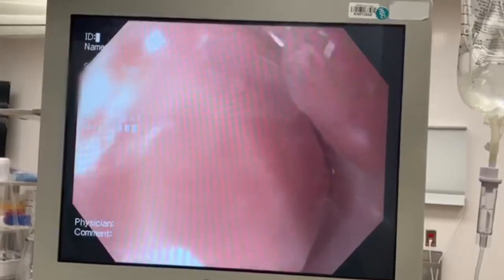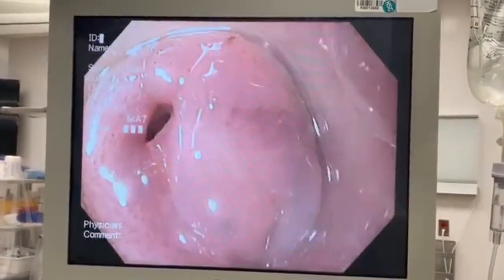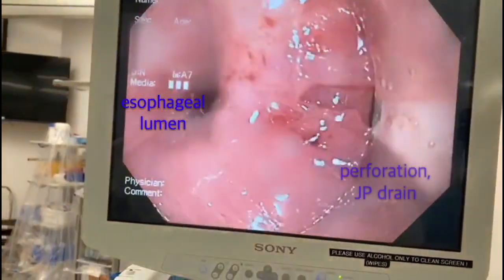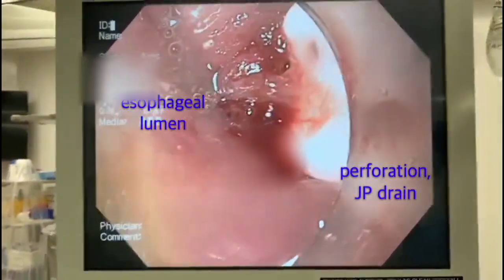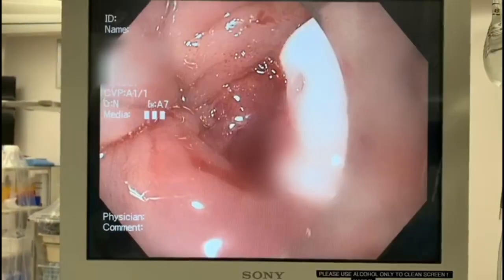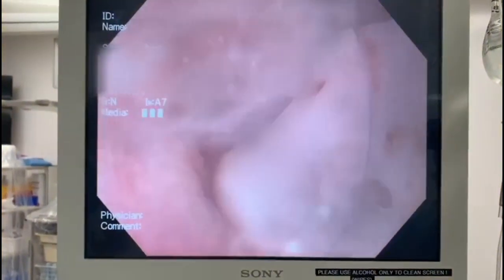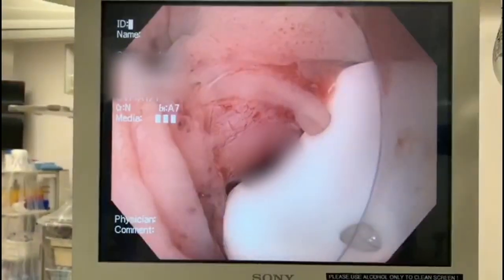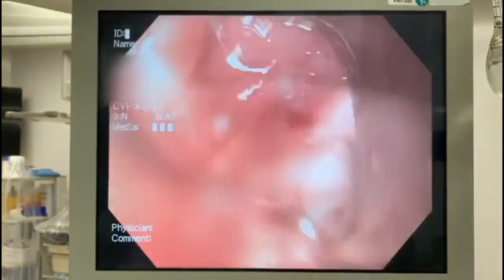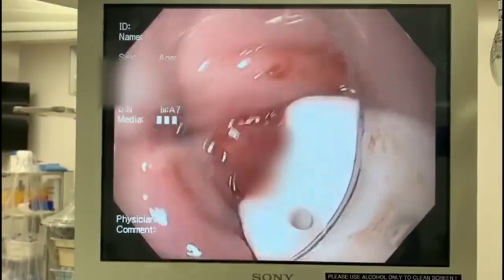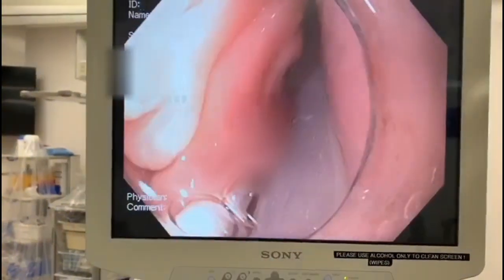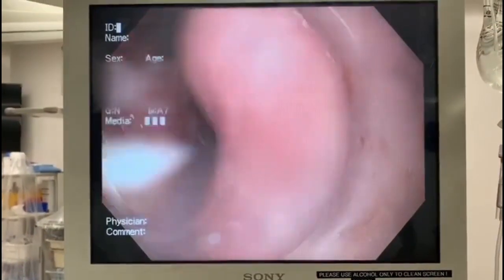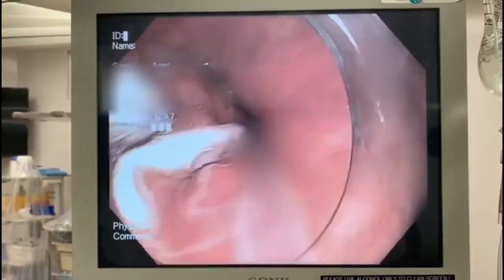A Jackson Pratt drain was placed transnasally and manipulated endoscopically into the abscess cavity. The cavity was further irrigated through the drain. The drain was coiled in the posterior oral pharynx, and traction was placed on the drain to straighten it.